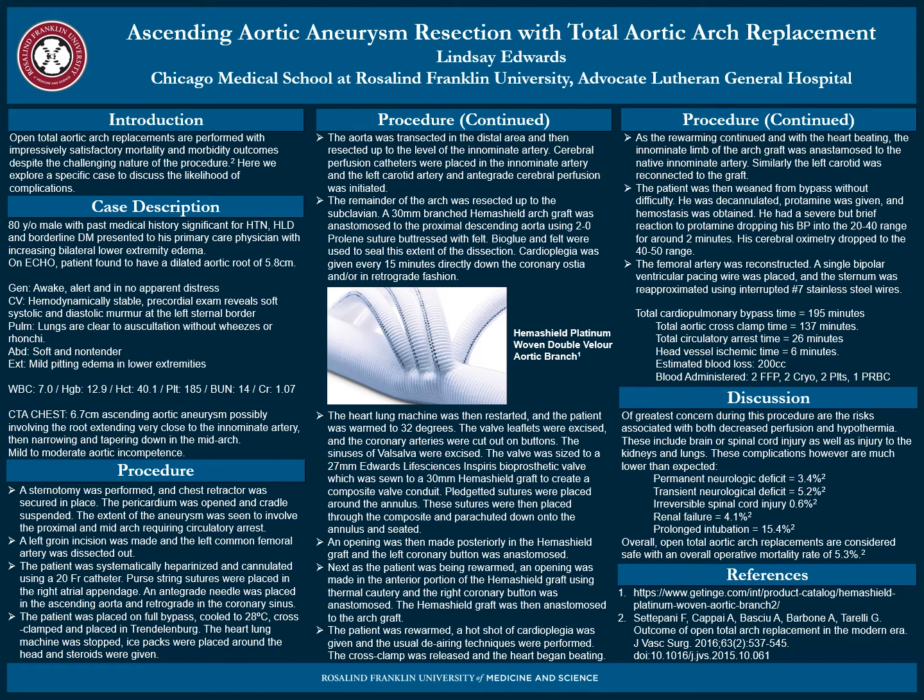I will be presenting an ascending aortic aneurysm resection with total aortic arch replacement case done at Advocate Lutheran General Hospital. Open total aortic arch replacements are performed with impressively satisfactory mortality and morbidity outcomes despite the challenging nature of the procedure. Here we explore a specific case to discuss the likelihood of complications.